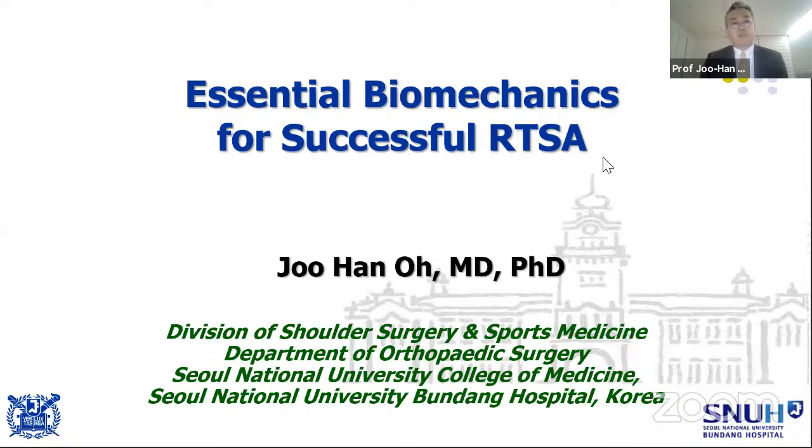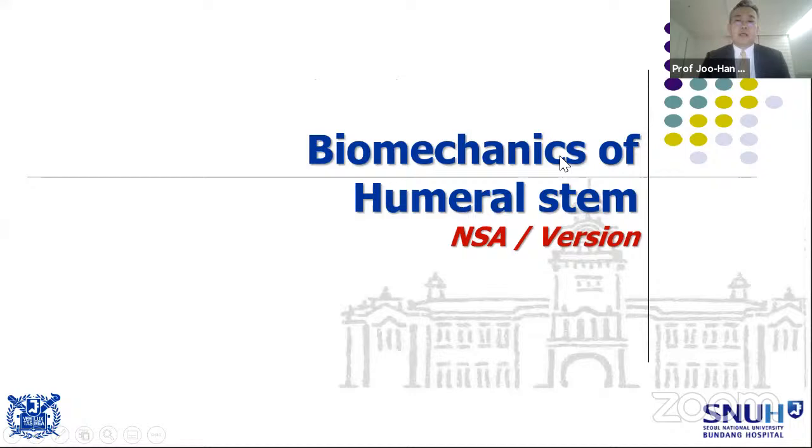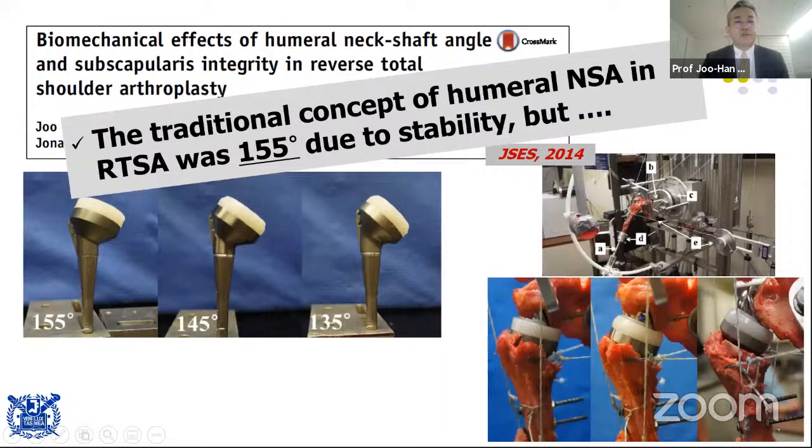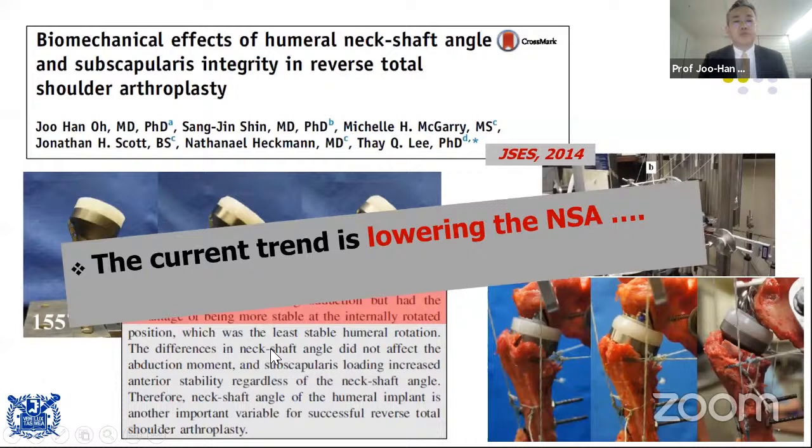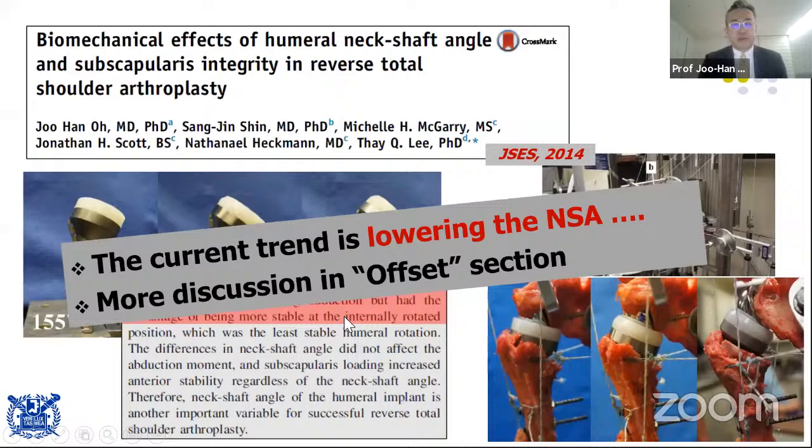I'd like to talk today about the essential biomechanics for a successful reverse. I'd like to start with the humeral stem. As you know, the traditional concept of humeral neck shaft angle, at the beginning, was 155 due to stability of the construct. But according to several studies, including my papers as well, the current trend is lowering the neck shaft angle, and we will talk about that in the offset session later.